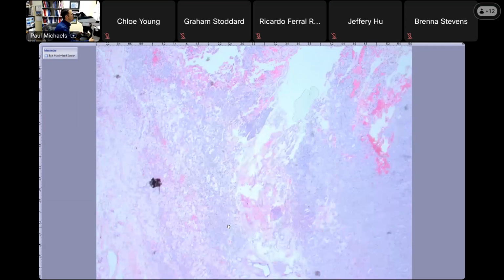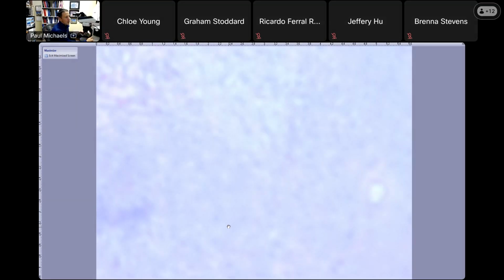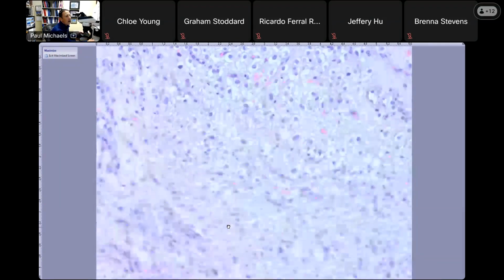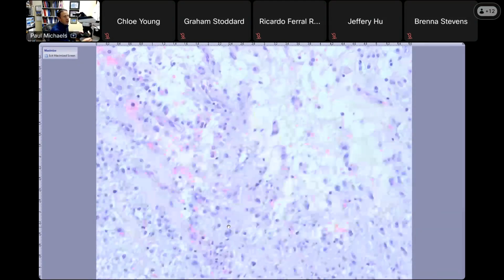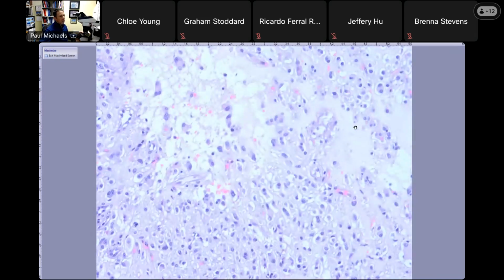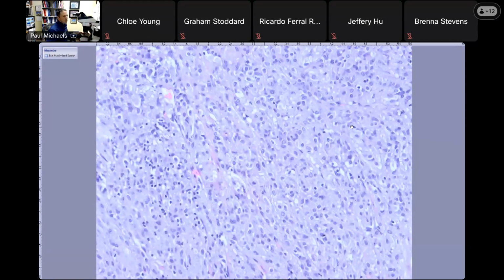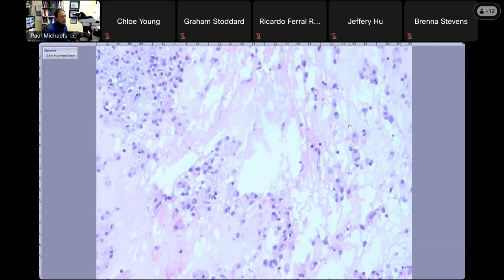Okay, what's this? This is something you often find in the stomach that can give you a lot of trouble on biopsies, even on resections. So this is very epithelioid looking, very myxoid looking stroma. But then here it kind of has a PEComa look. I feel like they look like PEComas. And then you start seeing multinucleate cells, rhabdoid looking cells. So when you have that in a stomach, a solid epithelioid to focally spindled growth pattern with myxoid stroma, here it's getting a little more spindled, rhabdoid multinucleate giant cells, or multinucleate cells, I should say.